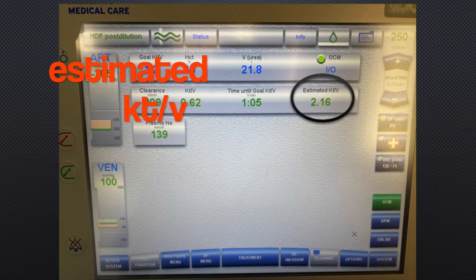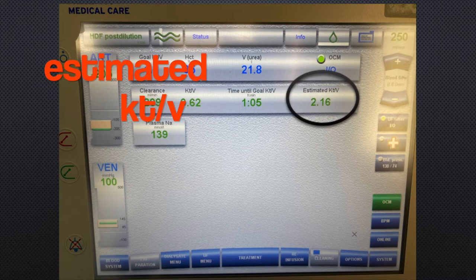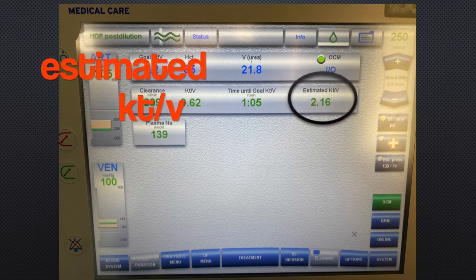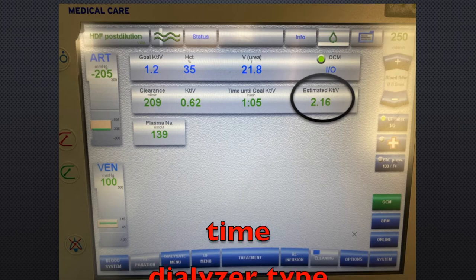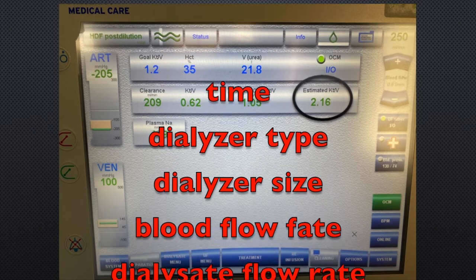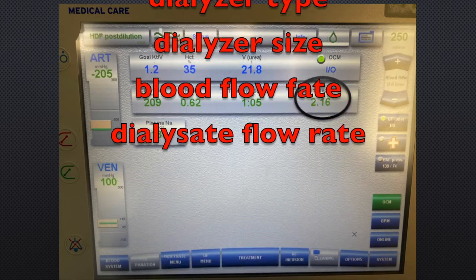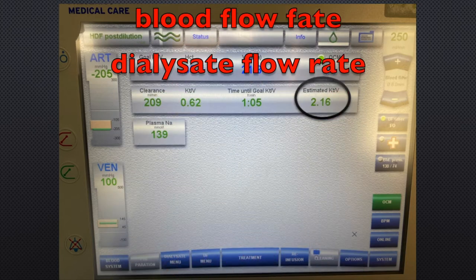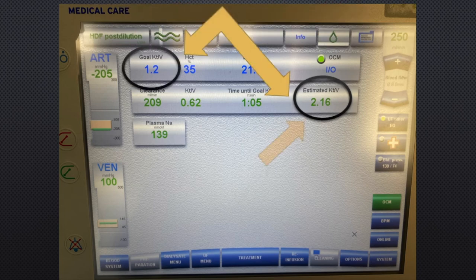The estimated KT/V gives you the predicted value once the patient finishes, based on the present parameters set in the machine — such as treatment time, type of dialyzer and size, blood flow rate, and dialysate flow rate.